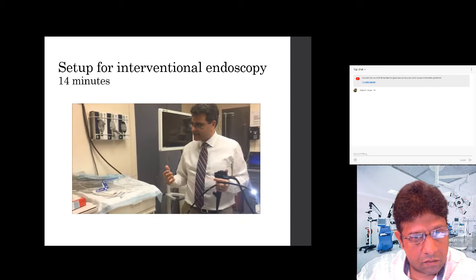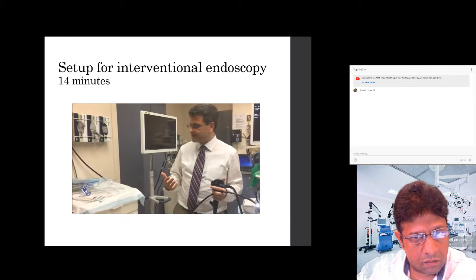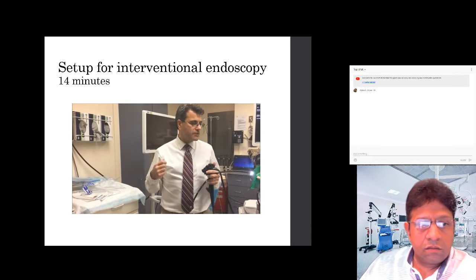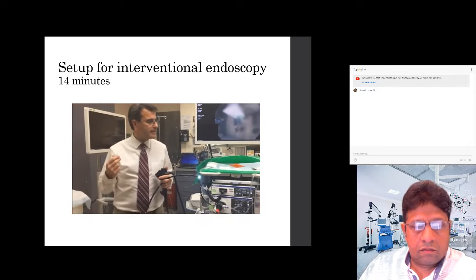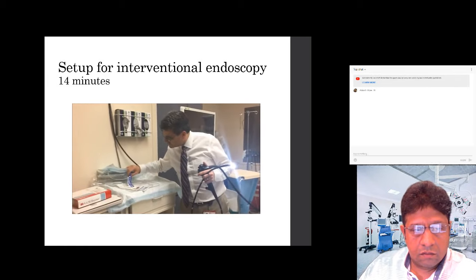The next emergency is GI bleeding, right? That's the big one, the dreaded complication that we all hate. And we have a couple of tools to take care of bleeding. The first, I guess, we'll probably start with is just an injectable, right? The sclero needle. I think we have one here.